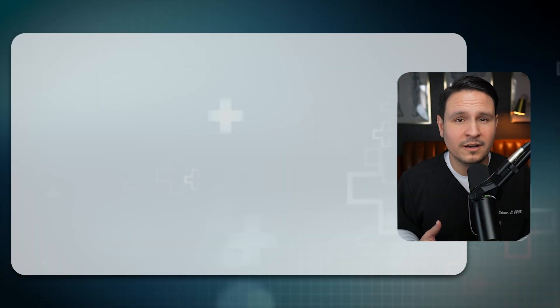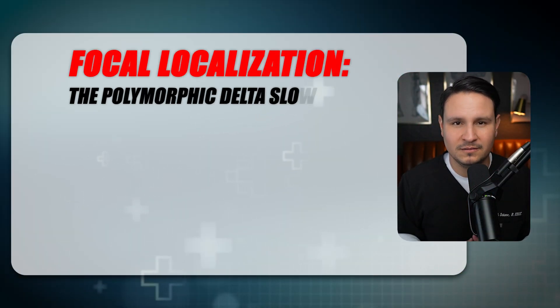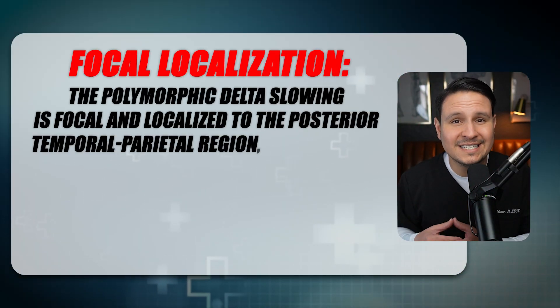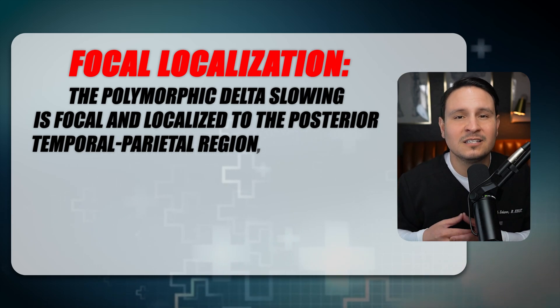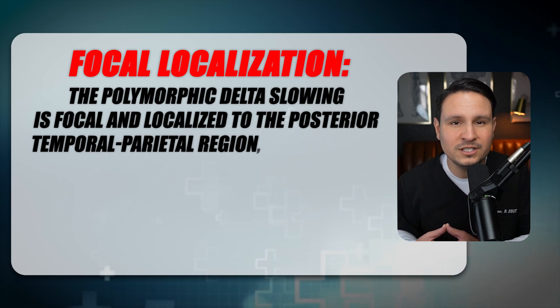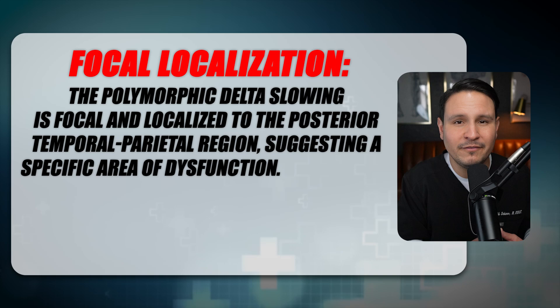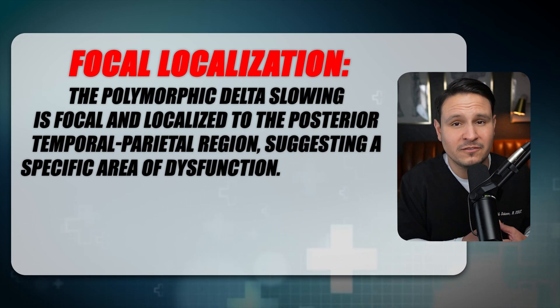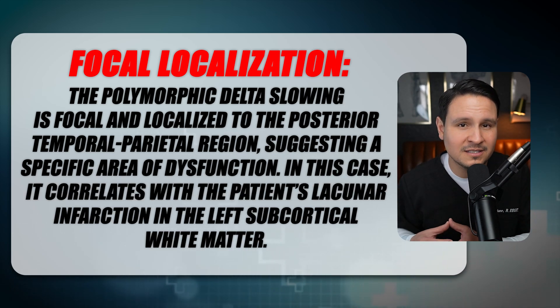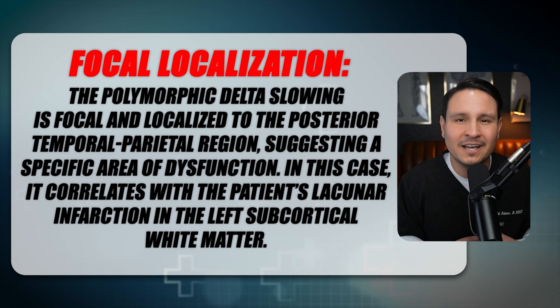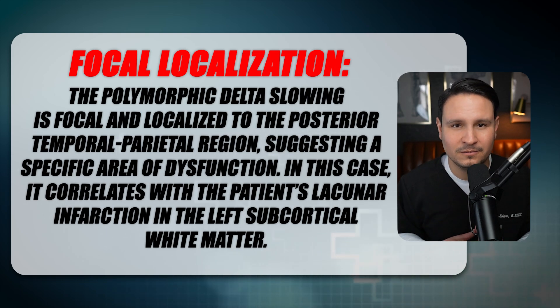Why is this EEG abnormal? Because of three unique characteristics. Number one: focal localization. The polymorphic delta slowing is focal and localized to the posterior temporal parietal region, suggesting a specific area of dysfunction. In this case, it correlates with the patient's lacunar infarction in the left subcortical white matter.